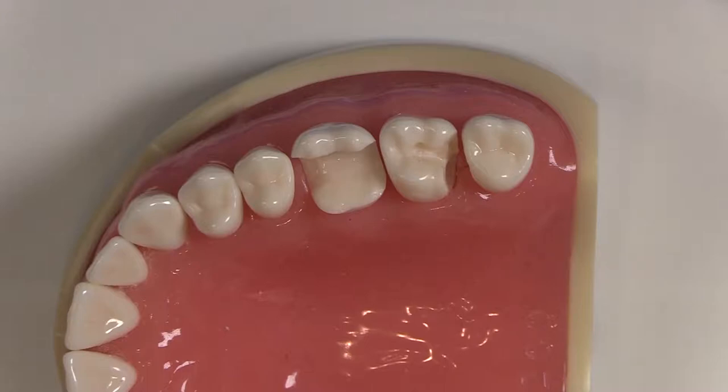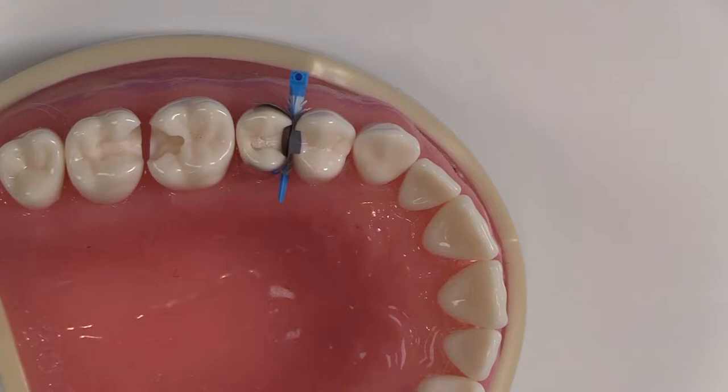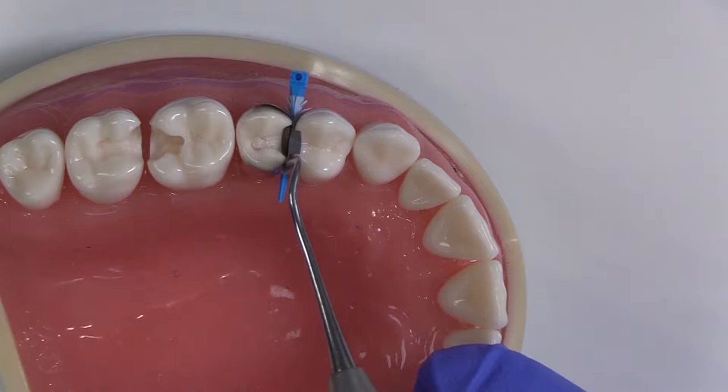Hi, this is Kevin with Garrison Dental Solutions and today we are with Dr. Matthew Najad in beautiful Beverly Hills, California. We are going to place the ring in place. I always like to use the tall size 3D ring, because it gives me the best adaptation all the way up onto the tooth.